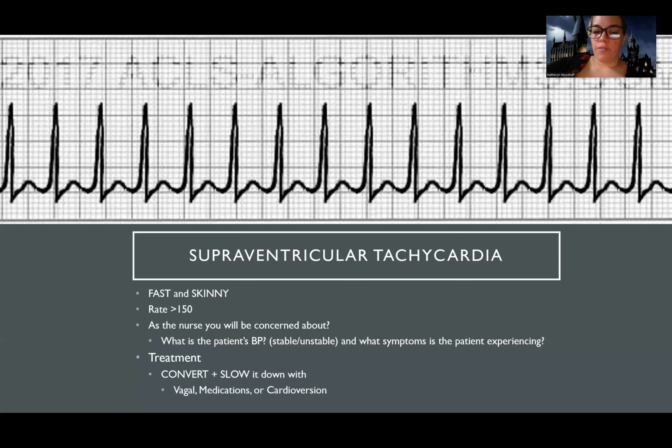I'm going to be most concerned for this patient about what their blood pressure is, because a lot of patients can go into this rhythm and some people know it and some people don't. I talk all the time about patients that are in a crazy rhythm. I go in the room and they're eating a peanut butter sandwich and saying, hey, what's the problem? And sometimes I tell them, hey, you're having an irregular rhythm. We need to treat this. And they're like, can I finish my sandwich first? And I'm like, hey, bro, we really want to get to the bottom of this. And so we always want to see if they're stable or not, but we're not going to sit there and let them finish that sandwich. Usually we want to get to the bottom and treat it. We want to see what symptoms they're experiencing, how they're feeling with it.